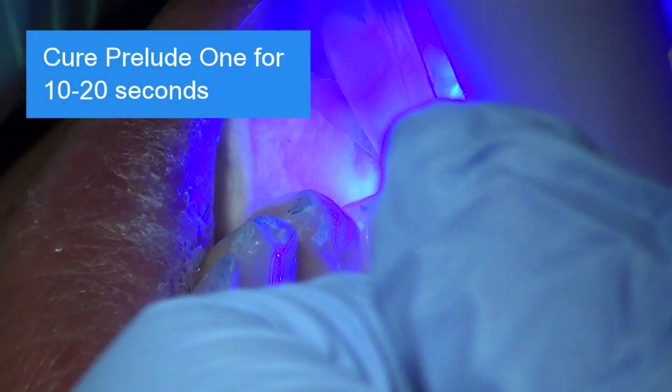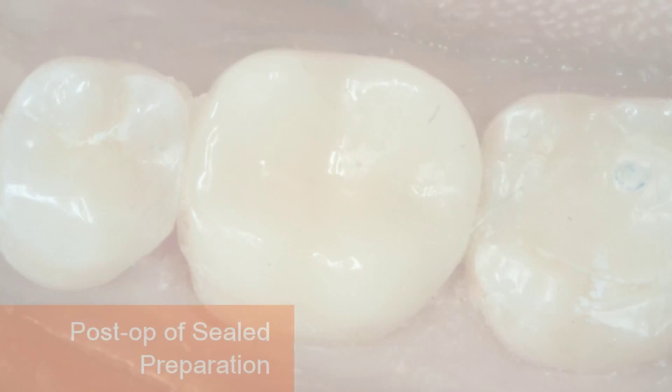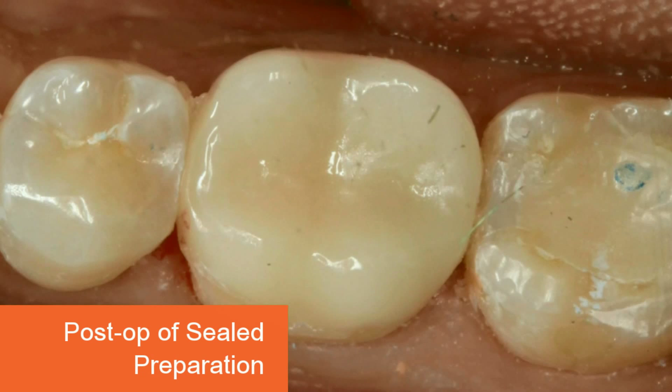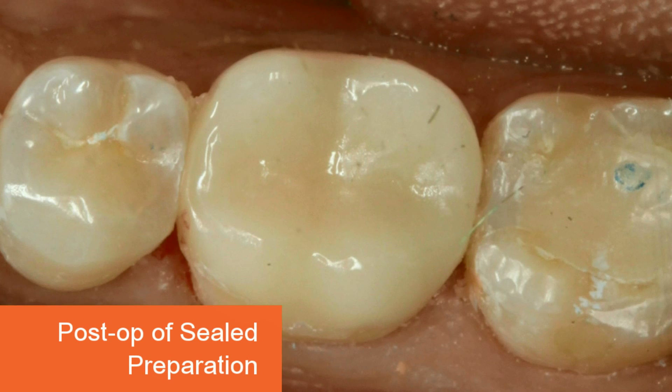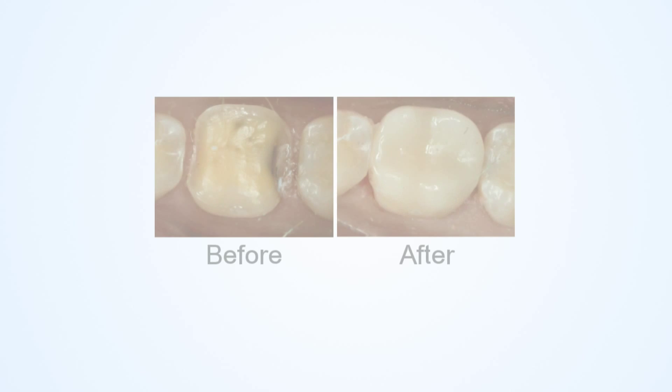Cure Prelude 1 for 10 to 20 seconds. The after photo is showing the final results achieved after about two minutes of clinical chair time. We've sealed the dentinal tubules and should have no post-operative sensitivity.